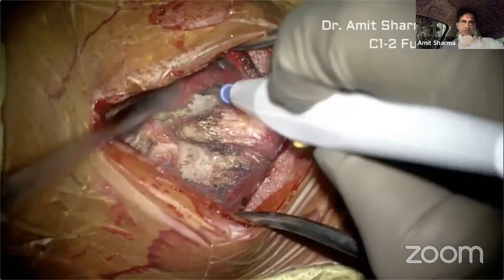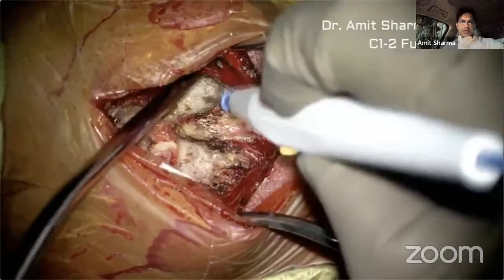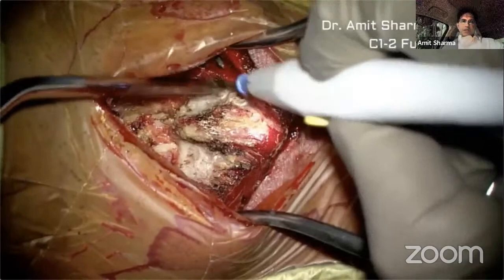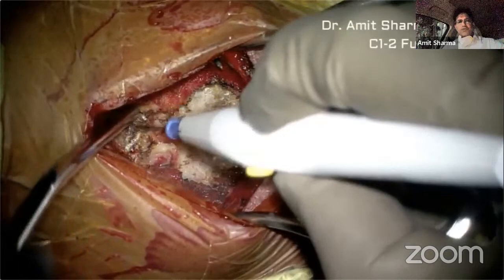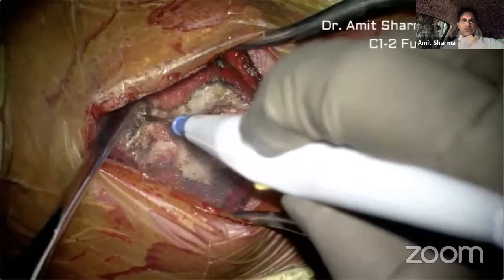It might be prudent to be careful while dissecting that you don't go too deep. You also need to prevent any injury to the C2-3 facet joint because that will unnecessarily disturb that joint. You need to go all the way lateral on the C2 facet joint so that you will be able to identify your right entry point, because you need to see the full boundary of the facet to decide your midpoint for the C2 pedicle screw entry.